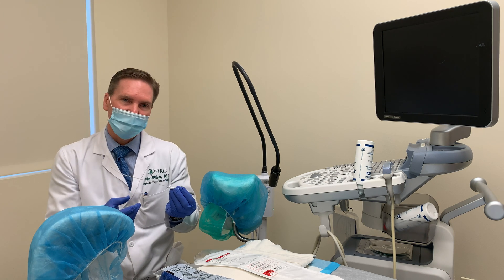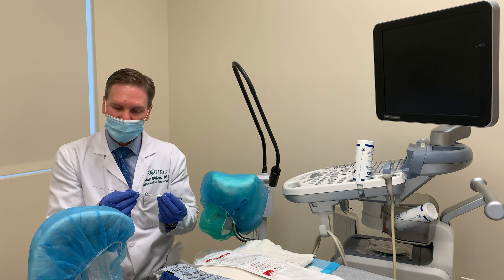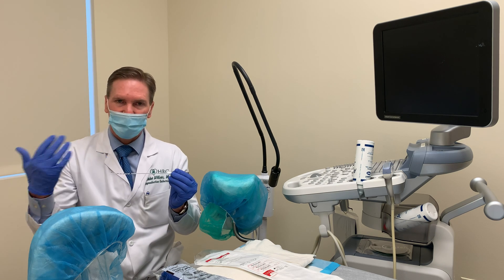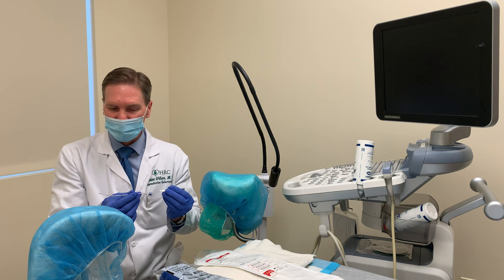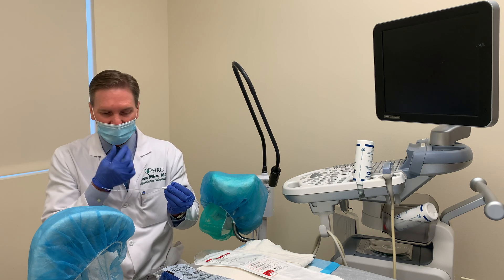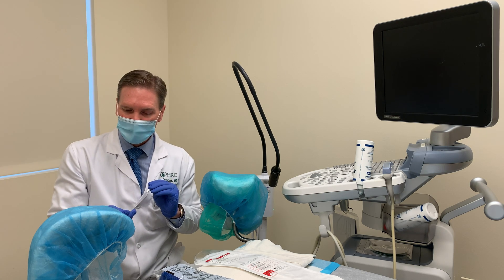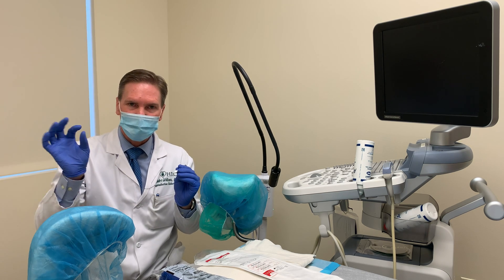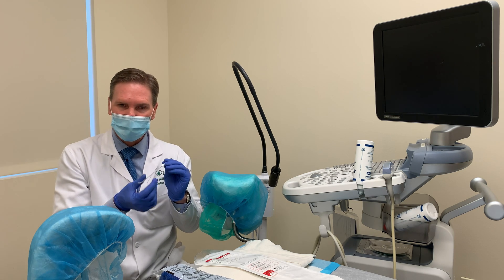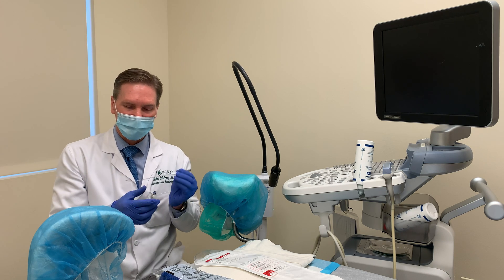We always pre-measure the uterine cavity — typically it's between six to nine centimeters — and that's already done in advance so we can use that as a third measure of how deep we want to be. In most cases we want to deliver the embryo roughly one centimeter from the top of the uterus, or the fundus. We can actually see the fluid as it's released — it's a nice bright signal — so we can see it and make sure it stays in the right location as we gently move the catheter back out.